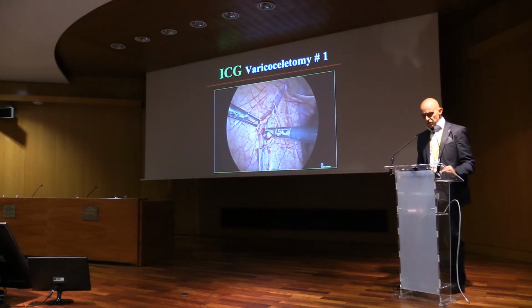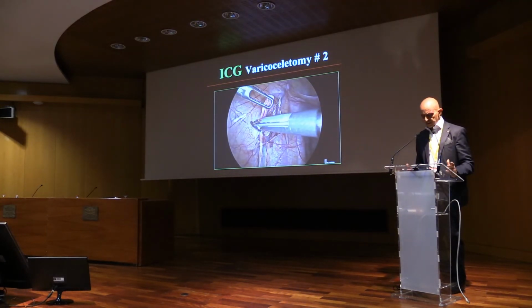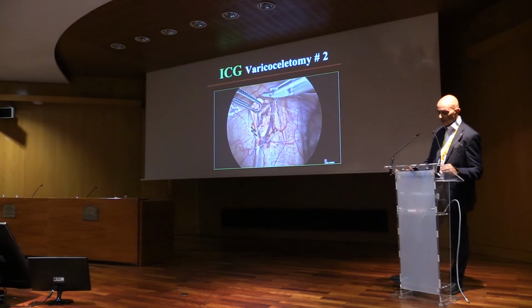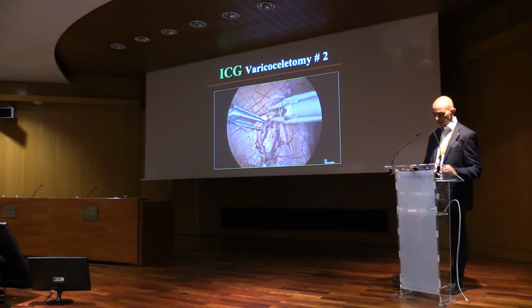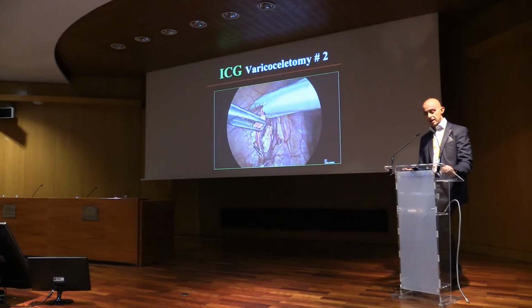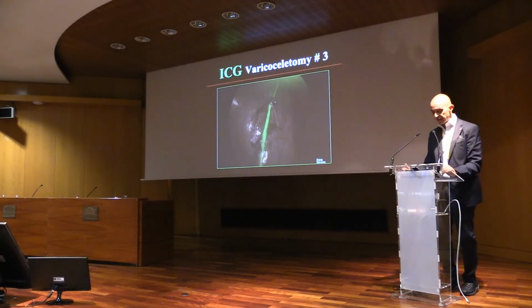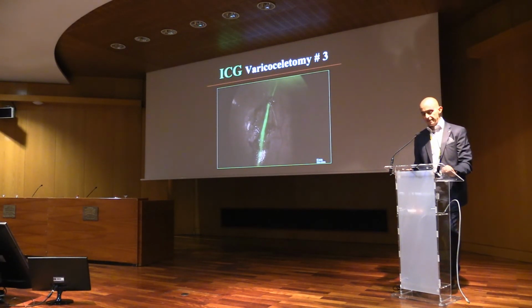And then you can isolate. Next. You can clip and section as usual. Very, very safe procedure and fast procedure to perform thanks to ICG. Next slide. And then this is the end. You can check, you save the lymphatics that are saved.